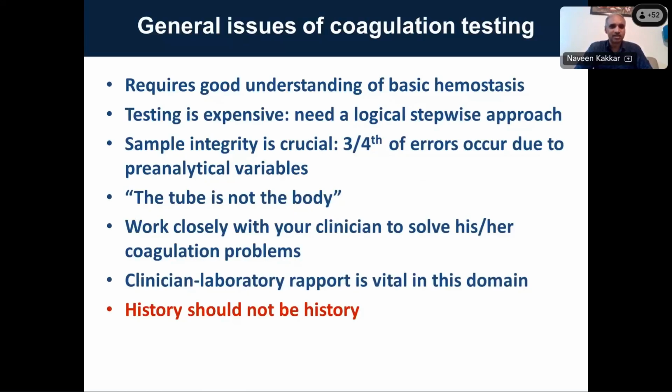This is a fact that is talked about, but clinicians usually do not agree, because if there's a problem, they will hint at the lab, but quite often the sample has the problem. Also remember, when we do a PT, aPTT, TT, or a factor assay, the tube in which we test is not the body. The tube does not have endothelium. So we are looking at the factors in a liquid milieu with calcium depleted and then calcium given, but there is no interaction of the endothelium. Although it tells us a lot, it does not tell us the whole story.